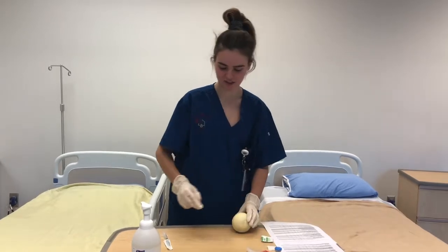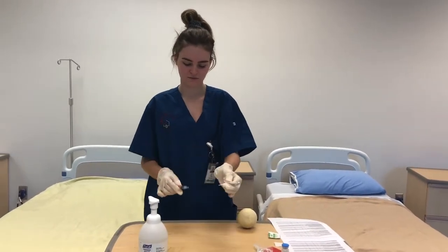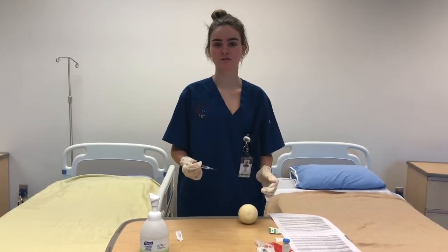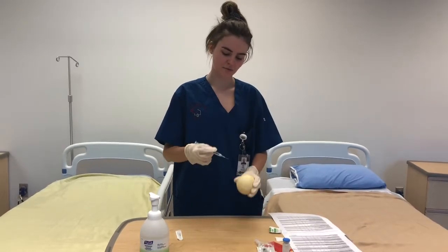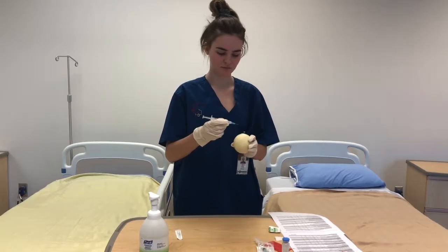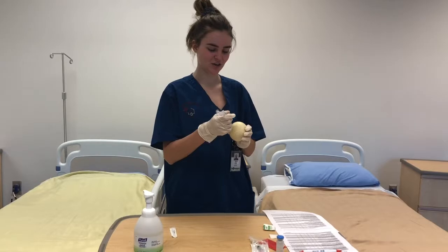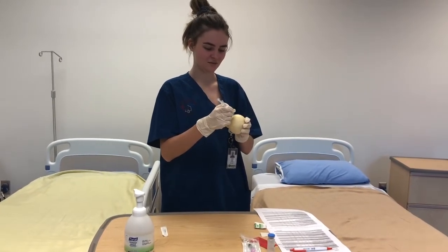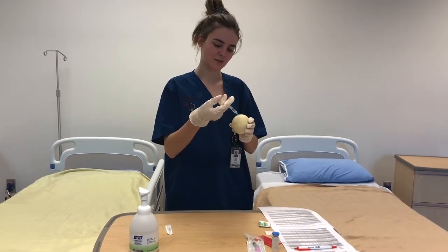So once the injection site is cleansed, I will be removing the cap from the needle, and I will be inserting this at a 45-degree angle for proper insertion, and the 1 milliliter of heparin will go into my patient's abdomen. So Mr. Mancini, on the count of 3, I will be injecting your heparin. Here we go, 1, 2, 3, and I'll be inserting the needle and pushing in the heparin into my patient.